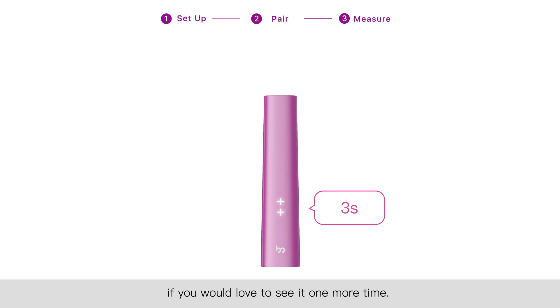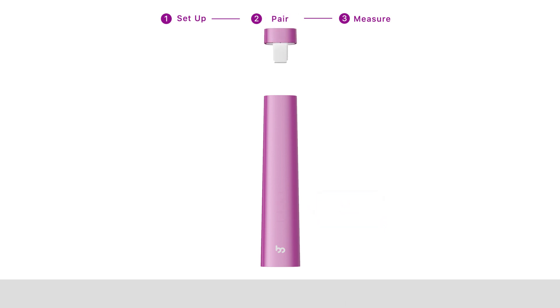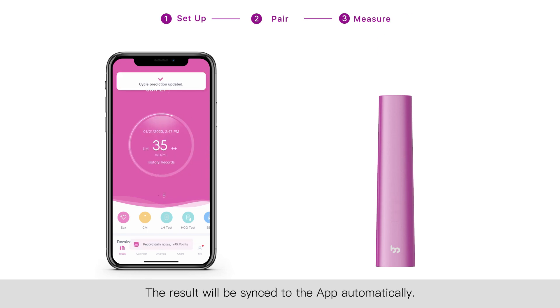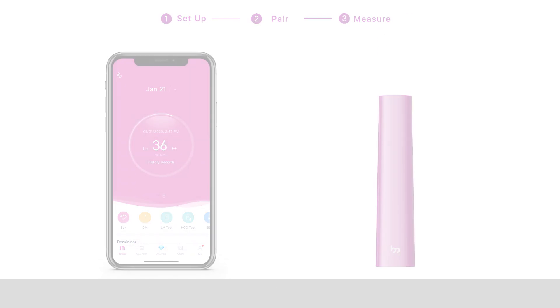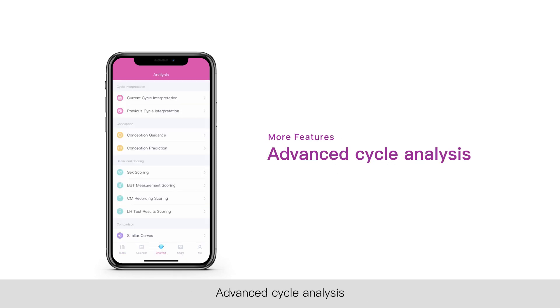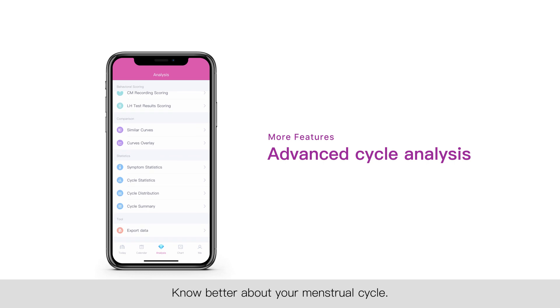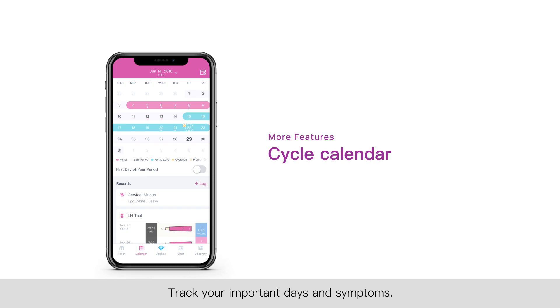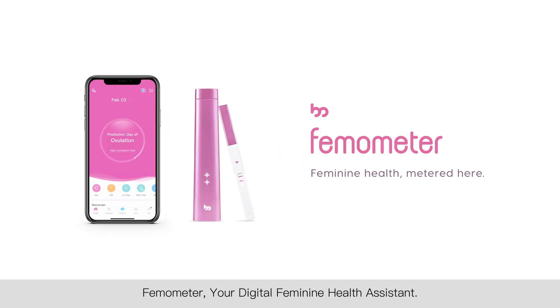Pull out the test strip and the result will be shown again for another three seconds. If you would like to see it one more time, open the Femometer app — the result will be synced to the app automatically. Other great features of the Femometer app include advanced cycle analysis to better understand your menstrual cycle, a cycle calendar to track your important days and symptoms, and your digital feminine health assistant.